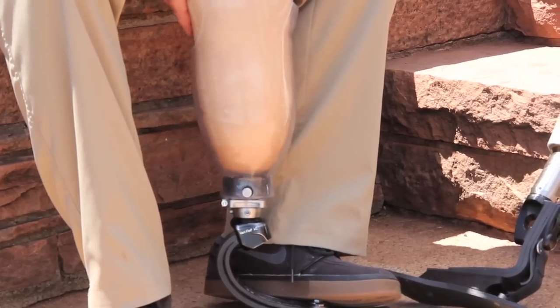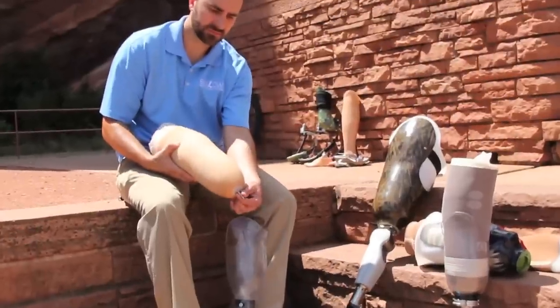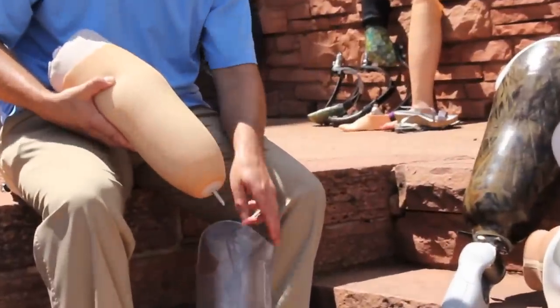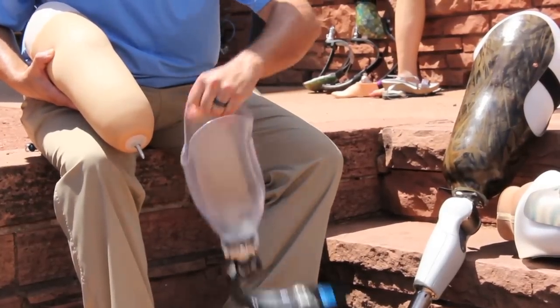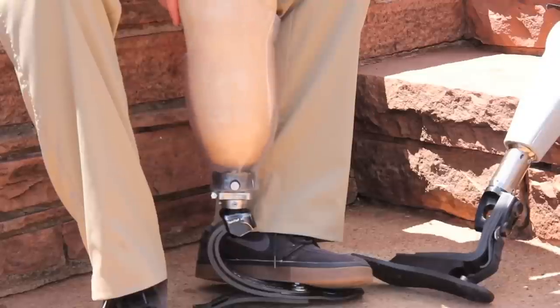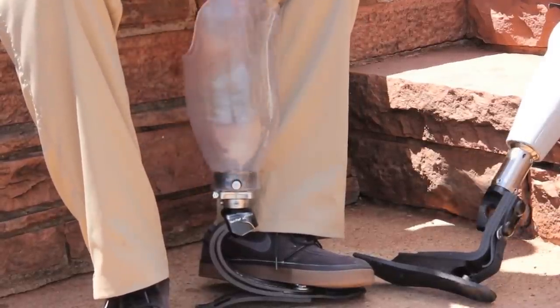Pin lock systems, either with transfemoral or transtibial. The pin lock is screwed into the distal end of the liner and secured firmly. There's a lock in the bottom of the socket that the pin ratchets into.